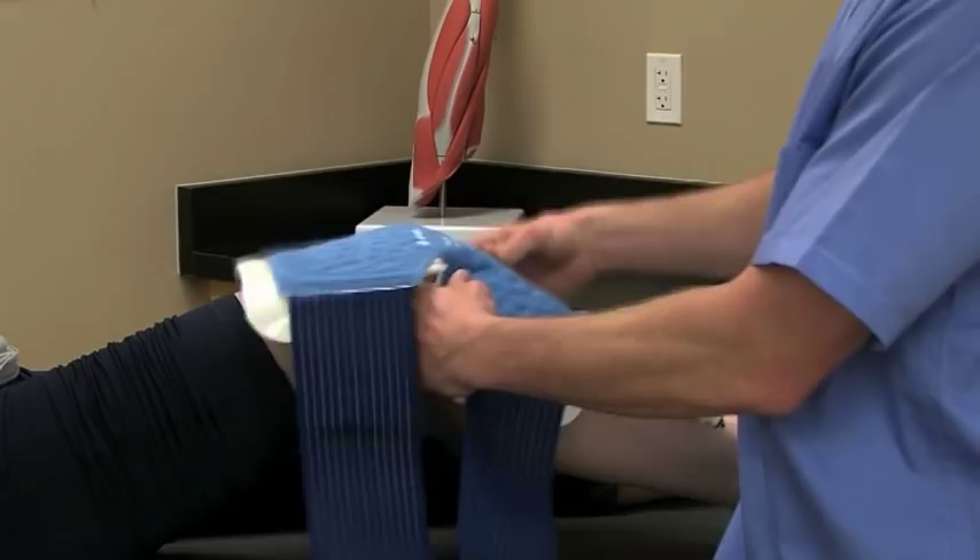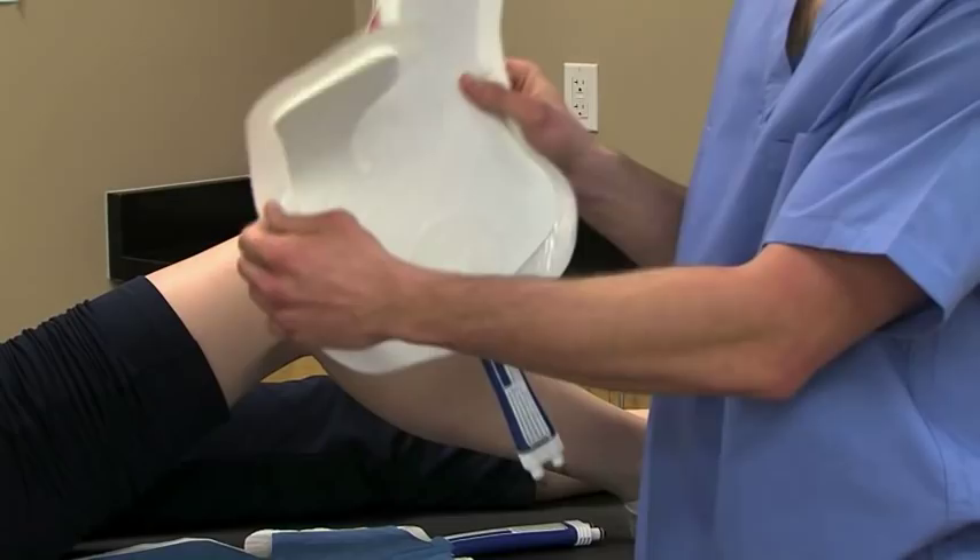With the insulation barrier in place, apply the Knee Pad with the blue side up if using a Wrap-On or IntelliFlow pad, or white side up if using a PolarPad.